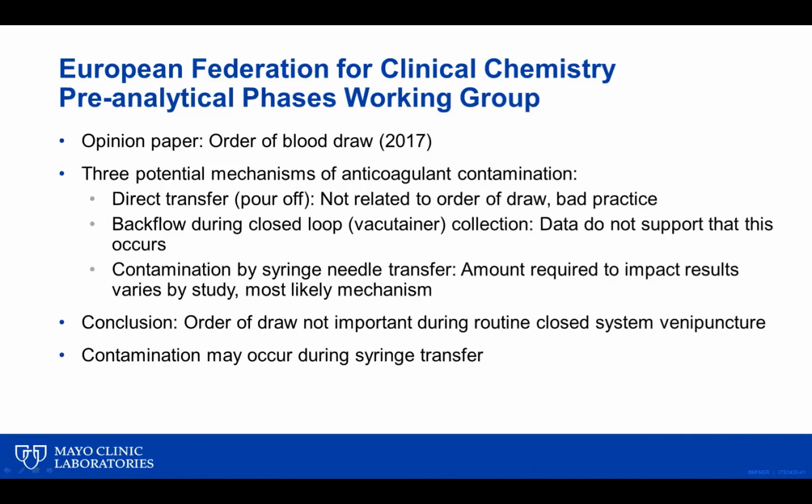And then the next mechanism is contamination by a syringe. So if you use a syringe to dose the tubes in the incorrect order, so for example, dosing the potassium EDTA first, then the serum, there is the potential to carry over some of that potassium EDTA from the purple top EDTA tube to the serum tube. And data on this, whether it really happens and how often it happens, is also somewhat spotty and controversial, but really that is what we're going to talk about next.